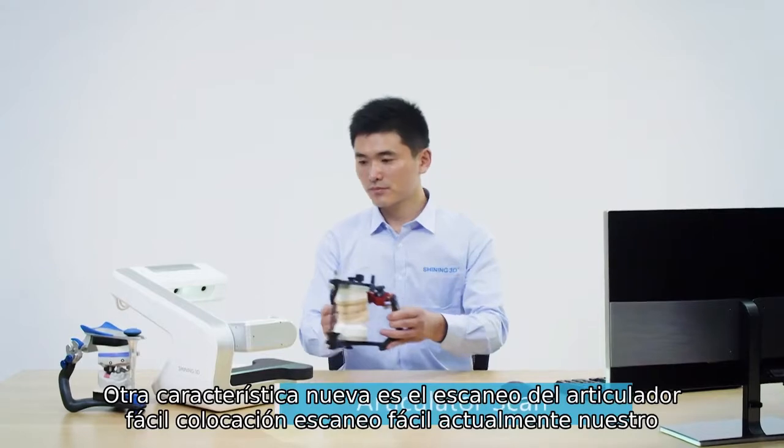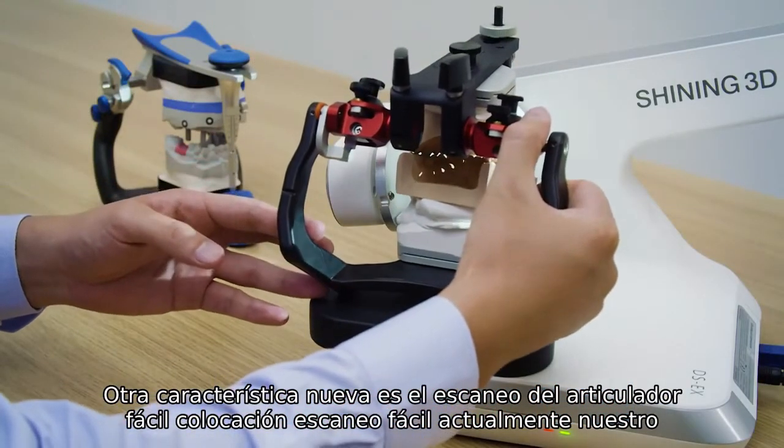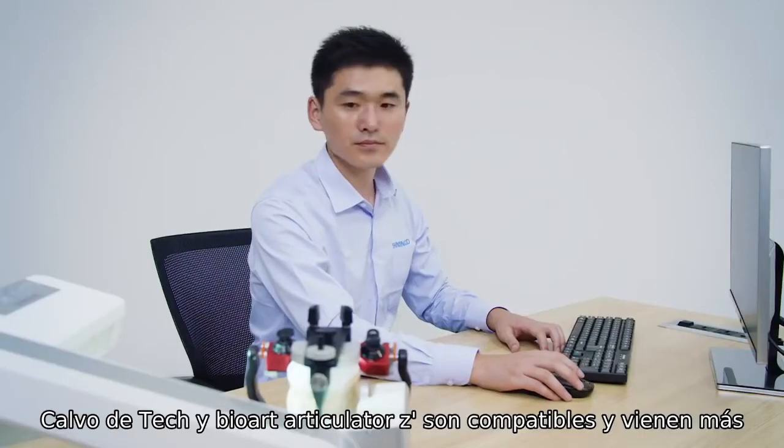Another new feature is Articulator Scan — easy placement, easy scan. Currently, Artex, CAVO, and BioArt Articulators are supported, and more are coming.